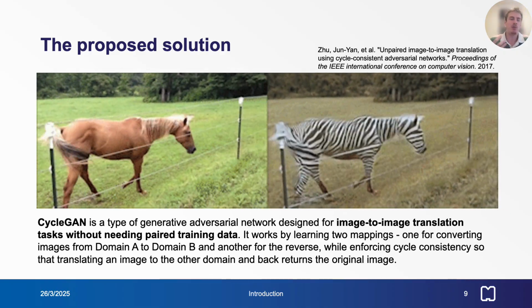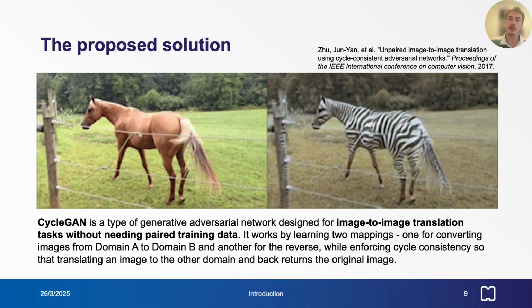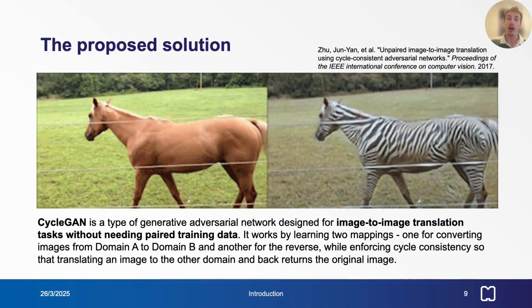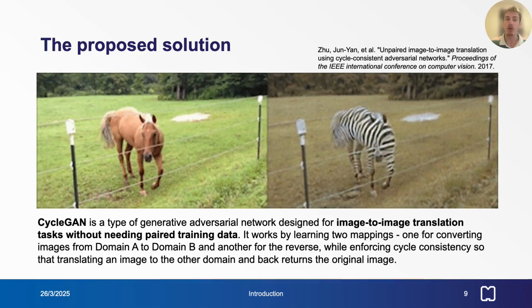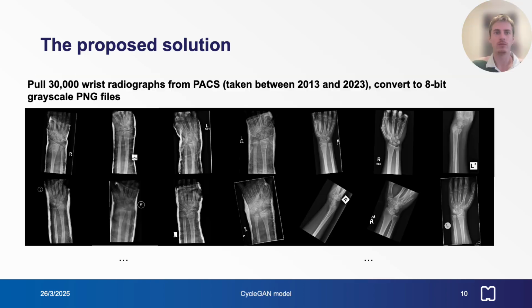You can see that this problem was initially conceived as one to map images of horses to images of zebras, but could be more broadly applied to image processing problems, such as that of cast suppression.